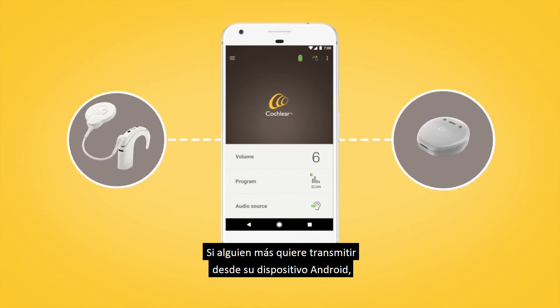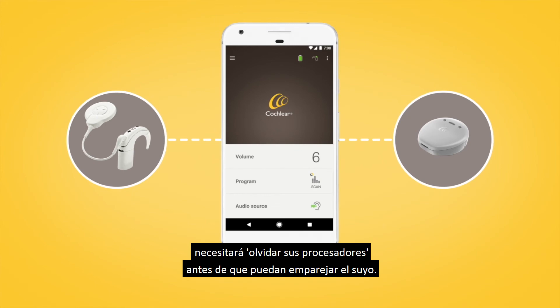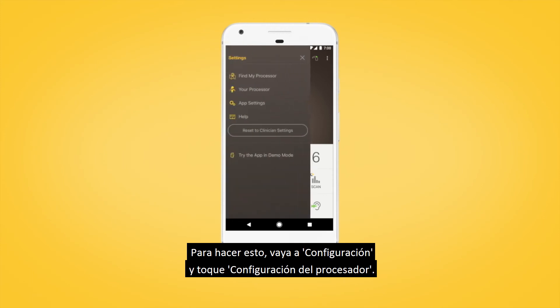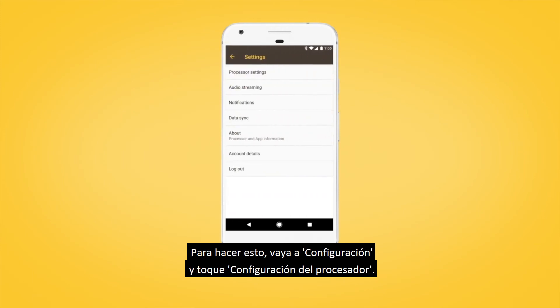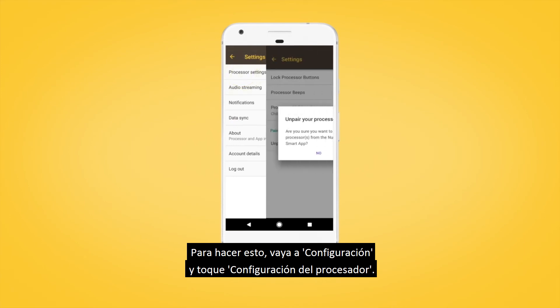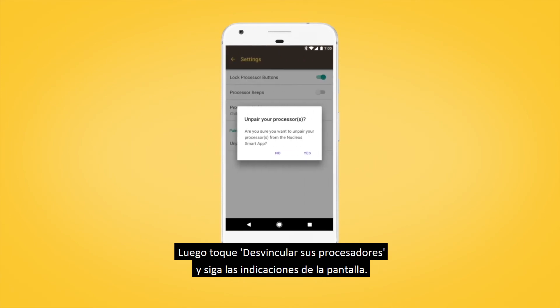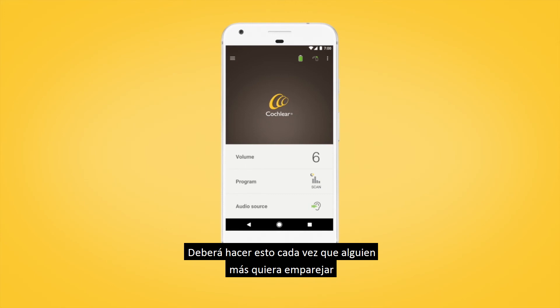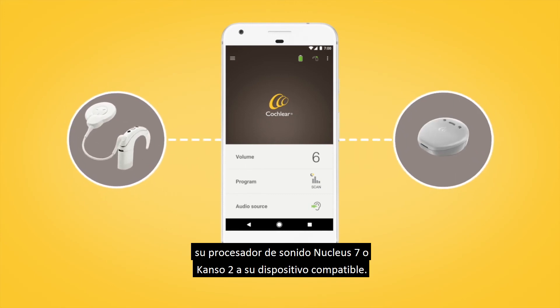If someone else wants to stream from your Android device, you'll need to forget your processors before they're able to pair theirs. To do this, go to Settings and tap Processor Settings, then tap Unpair Your Processors and follow the screen prompts. You'll need to do this every time someone else wants to pair their Nucleus 7 or Canso 2 sound processor to your compatible device.